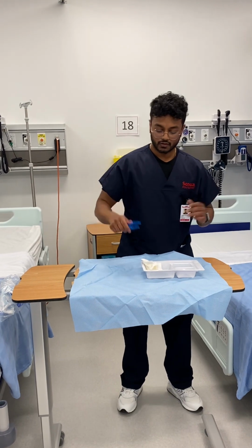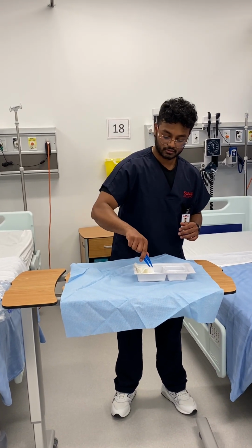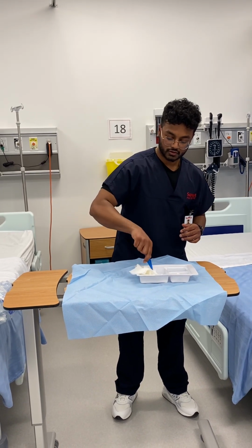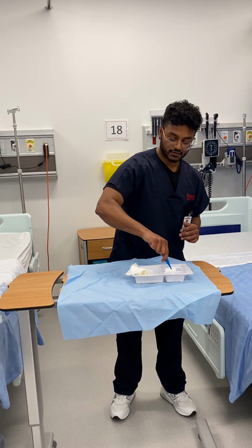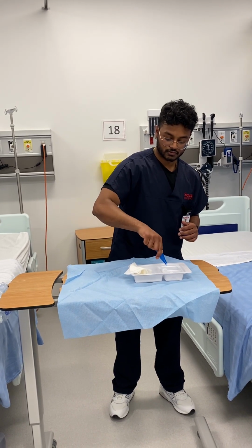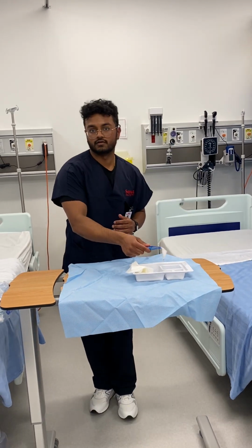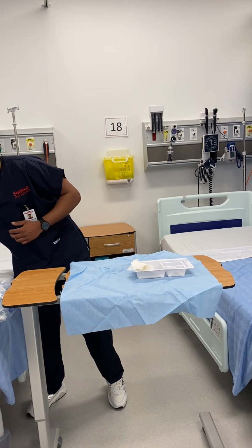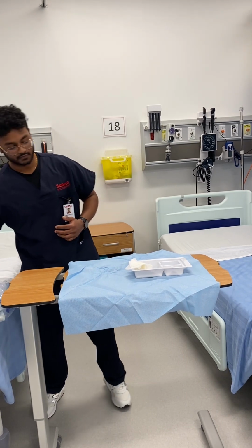Now to dress the wound, we'll be taking our 4x4. Oh, I apologize, we'll be taking our 2x2, dipping it in the sterile solution, and making sure to clean the wound. Cleaning the edges, eliminating in our waste.